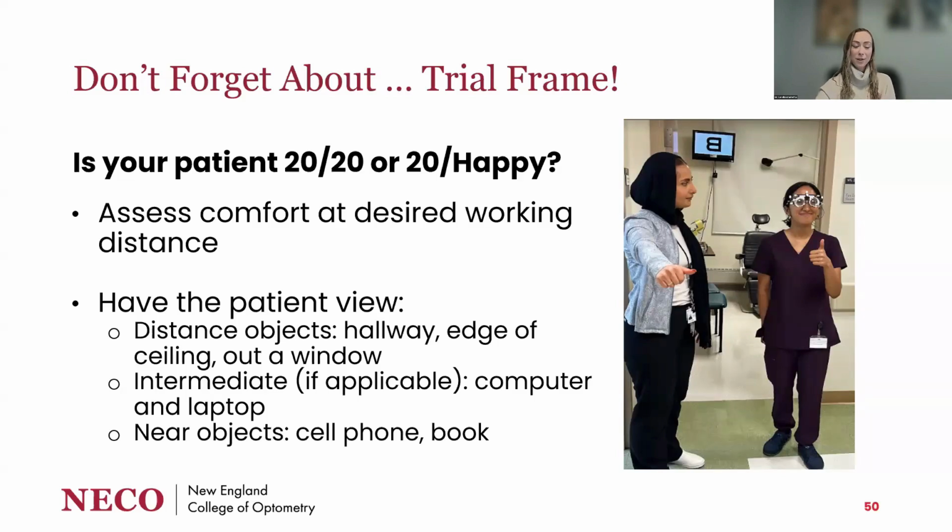I often have patients check their near add by using their own cell phone because that's something that's very applicable to every day-to-day life, or a book that they would read with a very comfortable print size so that they can show me their own working distance in case it's not exactly at that standard 40 centimeter working distance.